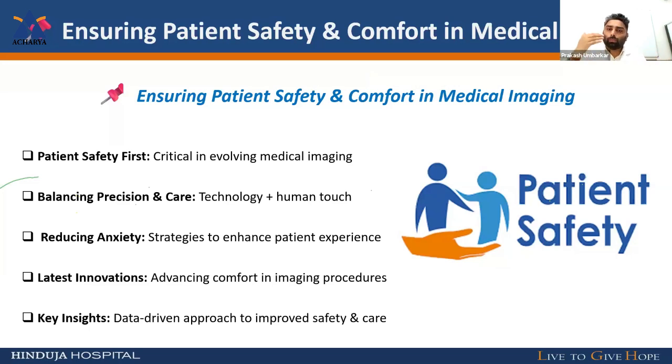And if your patient is moving during the treatment or the imaging procedure, we cannot get appropriate imaging. We have to repeat it multiple times, so the patient gets an extra dose. So make sure patients are comfortable while taking your imaging. And the latest innovations, what are the imaging advances? We have to utilize them in your daily practice.